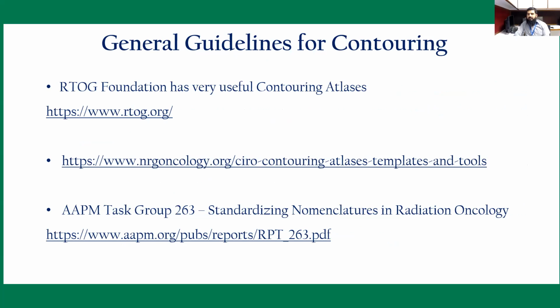These are some general guidelines for contouring. These are the RTOG foundations, and then we have the AAPM Task Group 263, which also supports the medical physics contouring or the normal OARs which we have to contour. Medical physicists have to contour before the optimization.